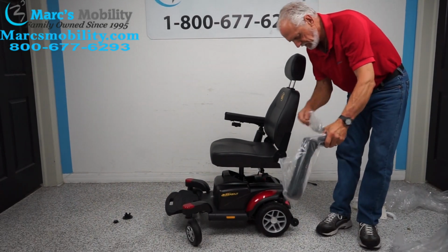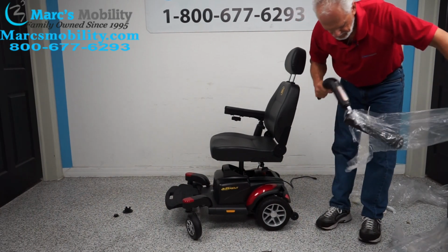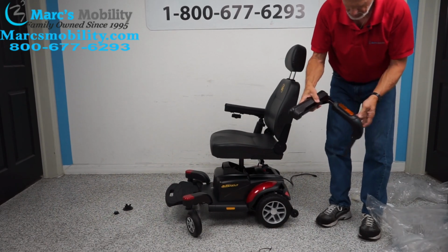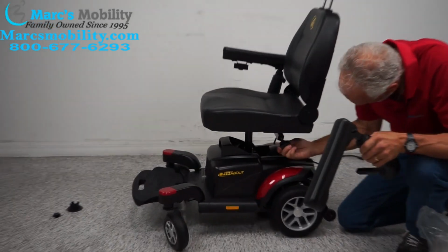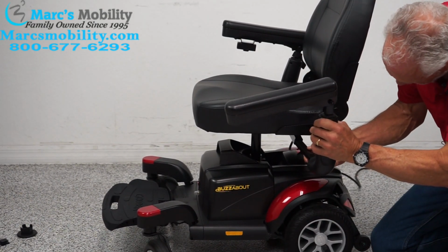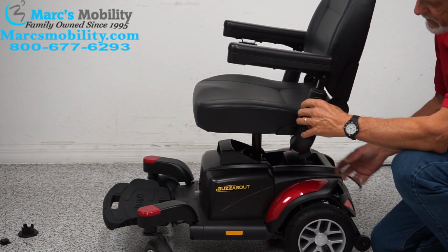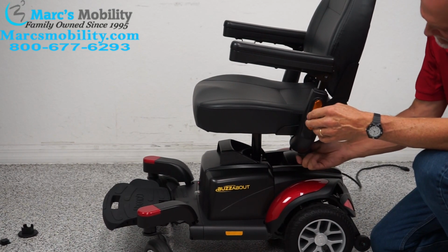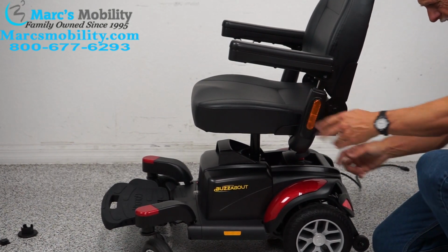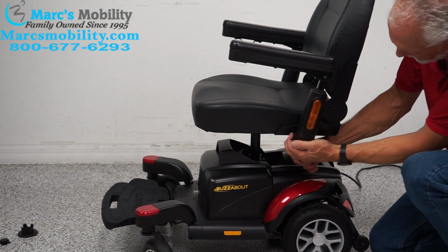So here's the other arm. Put the arm, there's a little thing right there. You have to unscrew this because there's a bolt in here. Notice how I've unscrewed it. And now we should be able to slide it in. Not enough, there we go. And then tighten it up, because if you don't tighten it up, you'll have that play like this. Tighten it up. And you're ready to go.